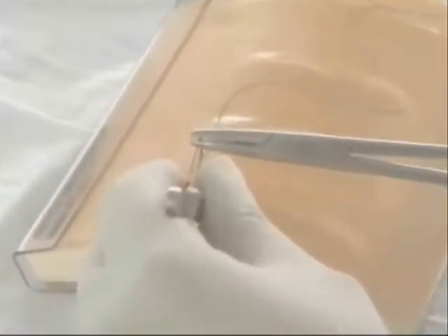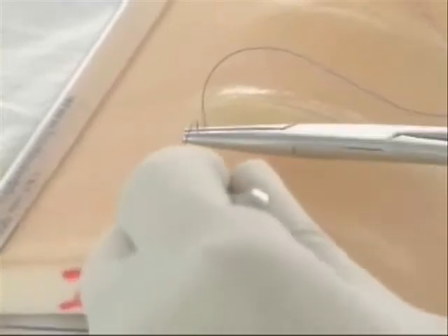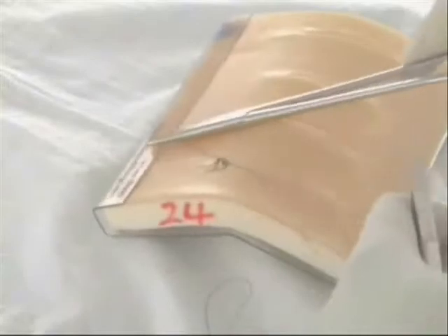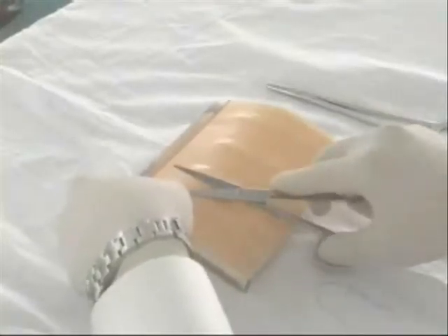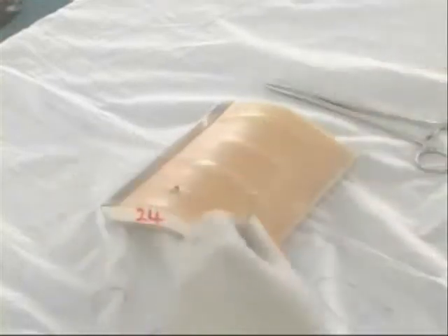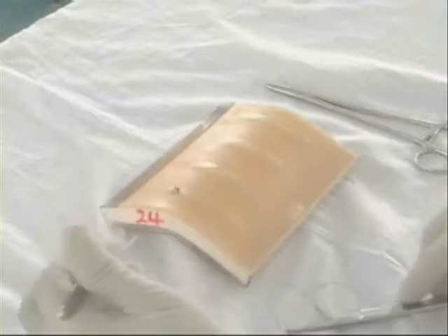To put the next suture, we take 0.5 centimeters from each side and follow the curvature of the needle, keeping it high. I can use hand or instrument — here I use instrument, using a surgeon's knot. If I go down and tilt the blade, I can get about 0.5 centimeters of control and bring the other blade to cut.